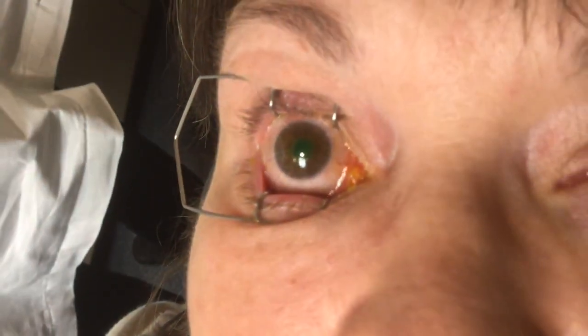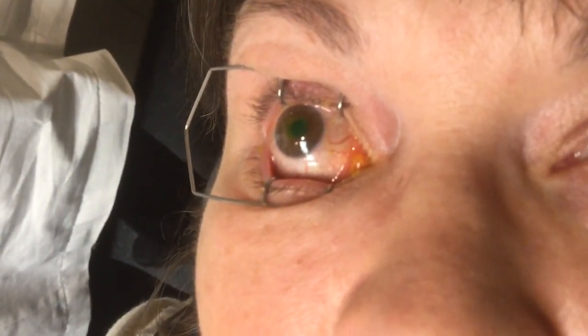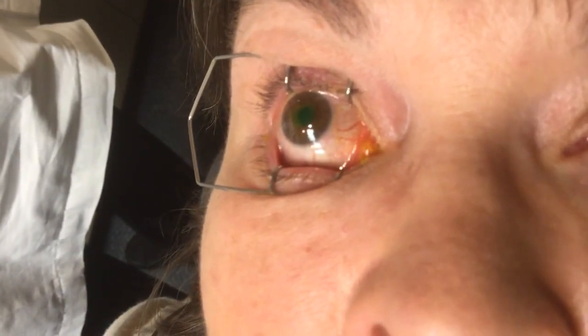Now this one — you see that IOP that's on there? It's kind of embossed on there. It has to go face down. It's the only one that has a requirement.